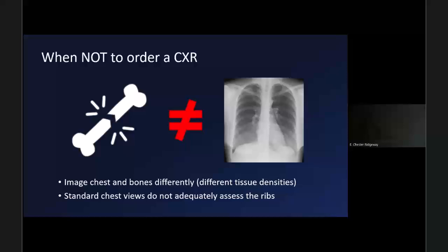Yes. So I have a follow-up question on that. I think you said this, but if I understand it right, I really want to drive it home. For rib x-ray, I've always thought about it being different positioning of the patient, but it's not just that. It's also that the electron beam is different. Yes. So we take the x-rays differently, just the actual electron beam. It's the strength of the beam that we use. That part of it's different, but we also position the patient differently. So you'll notice that on rib x-ray series, we get these additional oblique views, which really help lay the ribs out and increase our chances of seeing mildly or sometimes even minimally displaced fractures. And I'll show you a few examples of those.